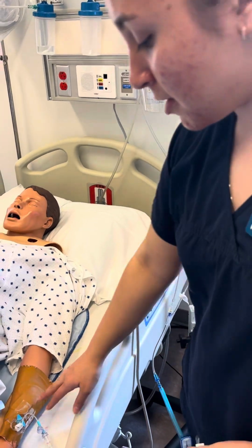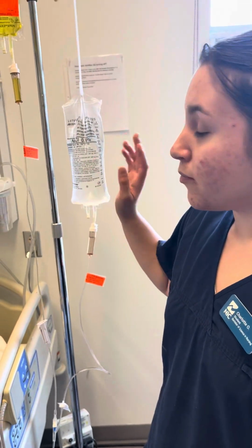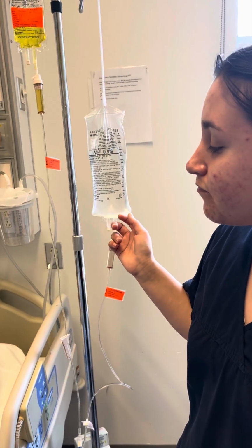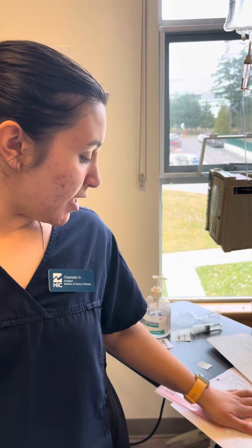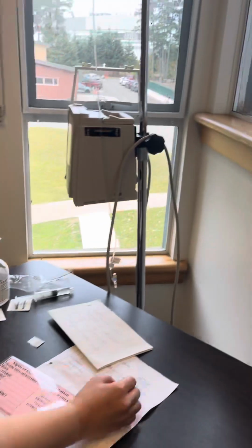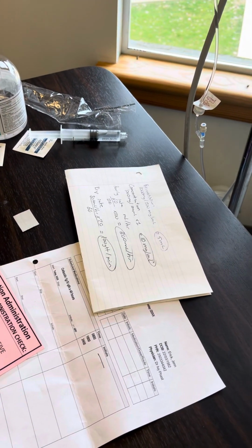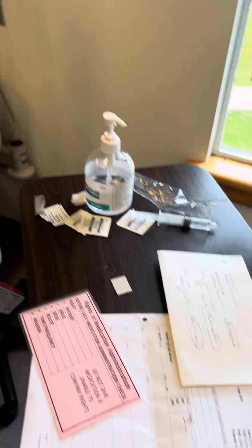I would document how the IV site looks, that I've checked all the lines, checked that I've compared it to the MAR, and I think that's, oh, and then obviously document on the MAR as well. And I would have a pen and I initial and then get another nurse to check it for me. And then another nurse would check there. Perfect.